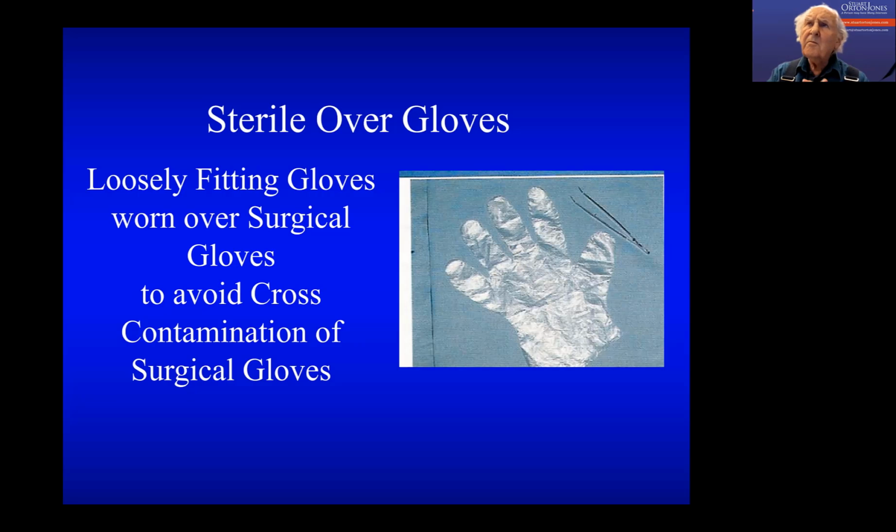Okay? Don't buy pre-sterilized gloves. It's a waste of money. Also, if you had 2 of these gloves double bagged, and if you need to use the X-ray unit, then your roving assistant would drop these 2 onto the aseptic surface, and then you can put them on. And then when you take them off, you throw them on the floor.